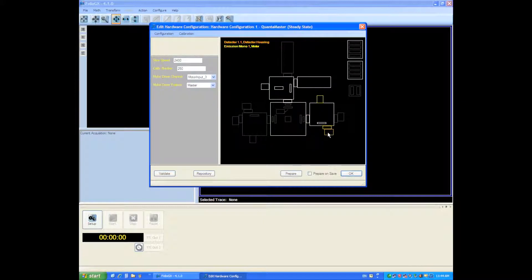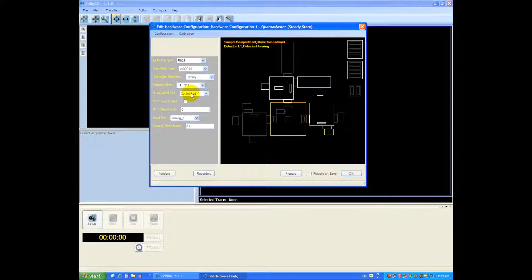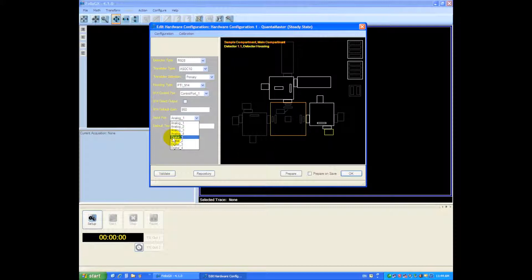The detector is an R928 photomultiplier and it's in a 914 housing so we're going to choose this housing. The default gain will be about 950 volts and the input port we're going to choose digital 1.